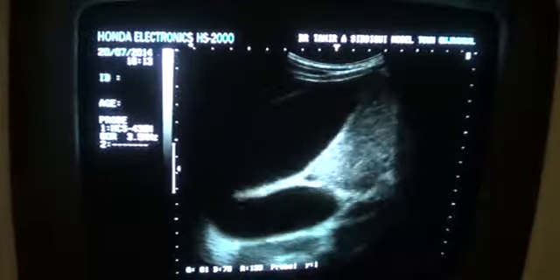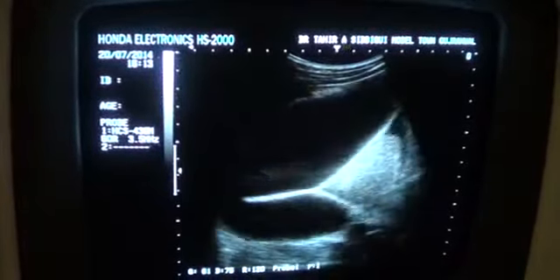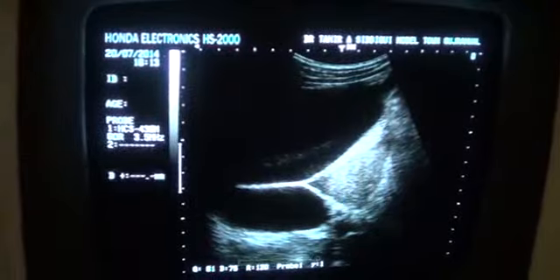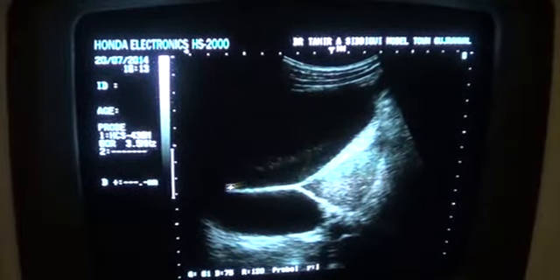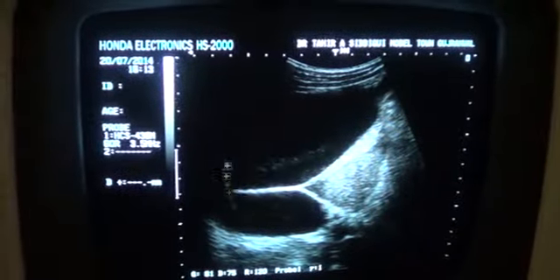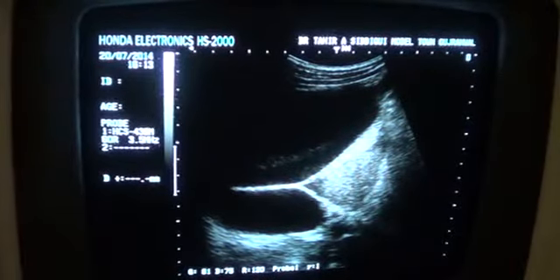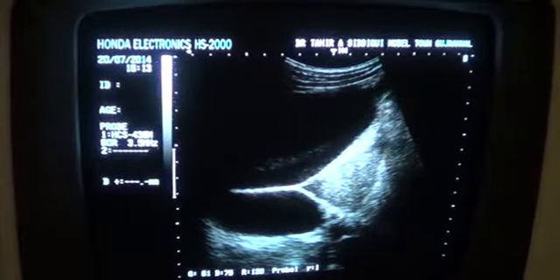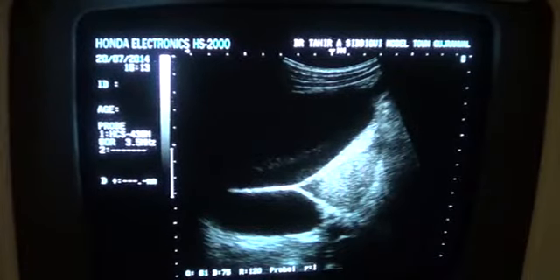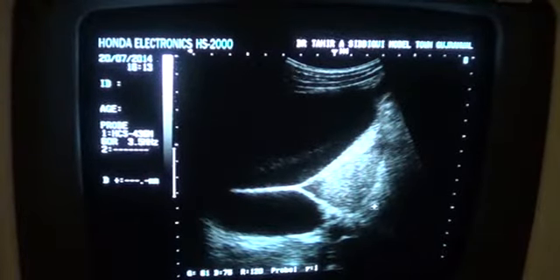You see, this is the longitudinal section of the gallbladder, with no calculus seen within its lumen, and no debris seen. This is a fold ending into the gallbladder lumen, whereas this is the gallbladder fundus, the body, the neck region, and from the neck region onwards we cannot trace the CBD with confidence. Now this is the part of the liver that you are seeing in this particular location.